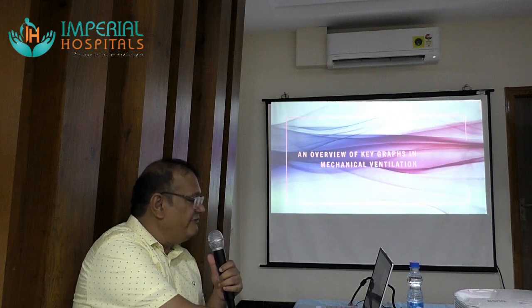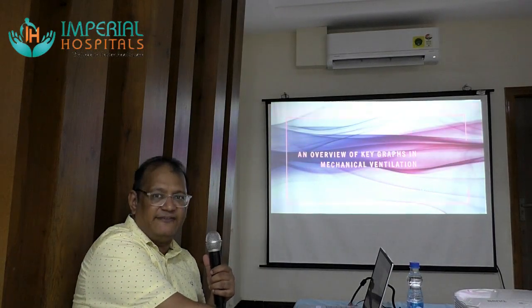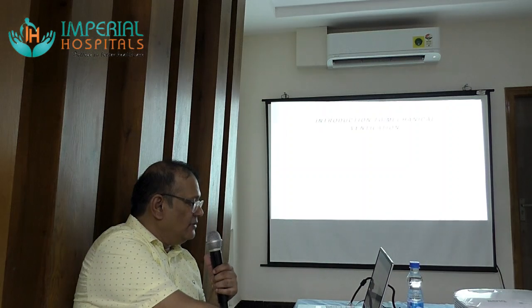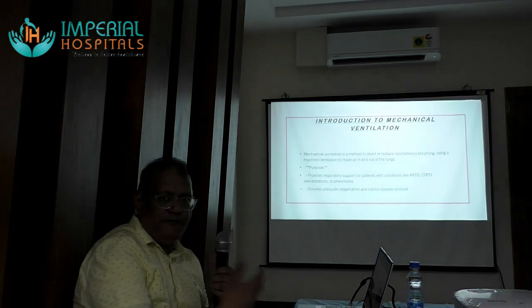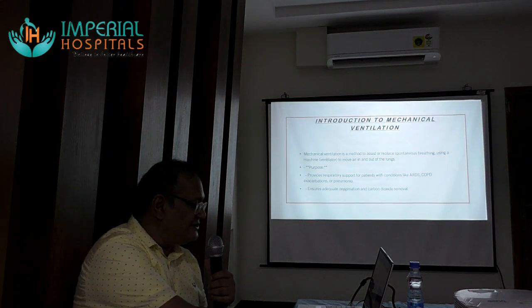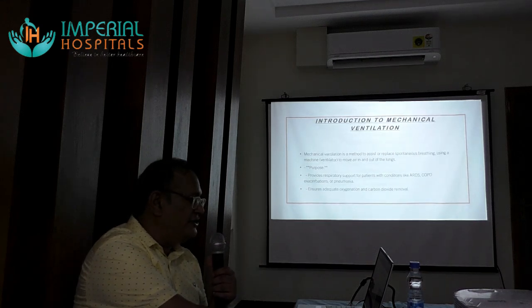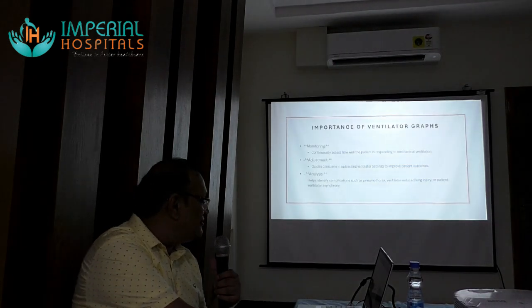Good afternoon, everyone. Today we'll have a brief discussion about the key graphical representations on a ventilator. So, we know that mechanical ventilation is the method to assist in breathing for the patient, right? We provide respiratory support for patients with conditions like ARDS, COPD, etc. And we use mechanical ventilation to ensure adequate oxygenation and removal of carbon dioxide. Right. So, what is the importance of ventilator graphs?